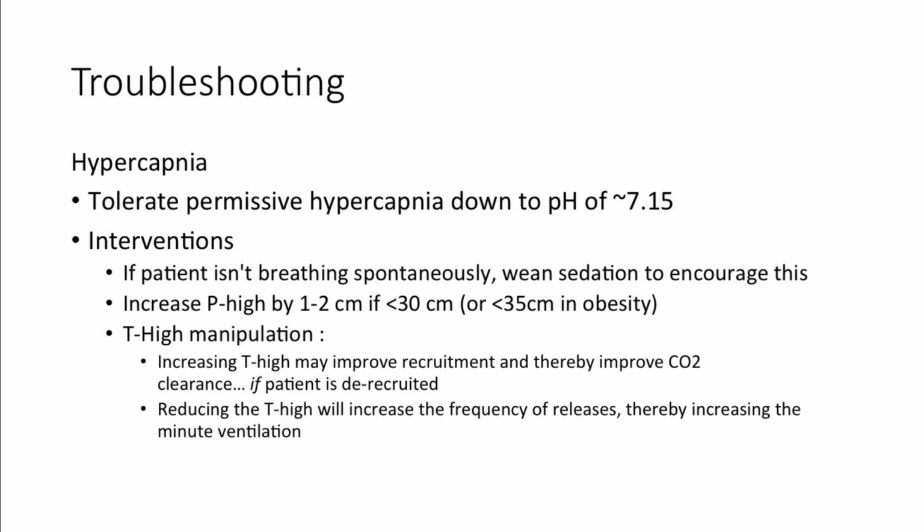If they're hypercapnic, then you want to increase the tidal volume in the same way as you would in a normal mode of ventilation, but it's a different way how you might do it. So you might try and get them to breathe on top of it. That makes it work much better. You might try turning up the P high. You might try fiddling with how long they spend at a high level. So you might give them longer, you might give them less. So basically you have to fiddle with it for that. But what I would do is I would try and increase the frequency of the release. So you can change the ventilator frequency from 10 to 12, whatever, and then I'd look at how their tidal volume during that release and perhaps lengthen the expiratory time so they breathe out more.